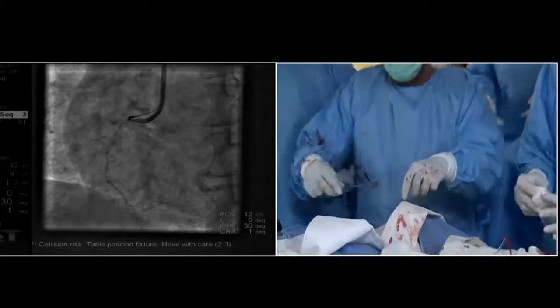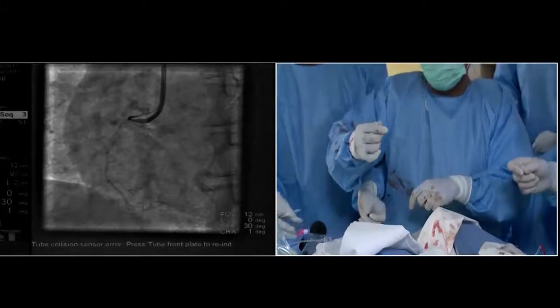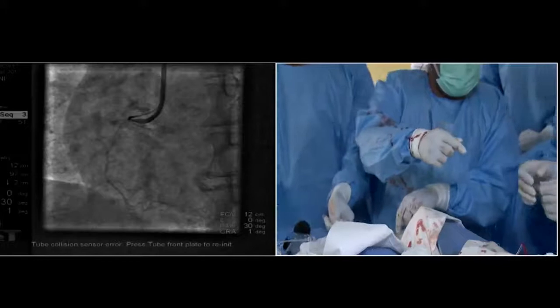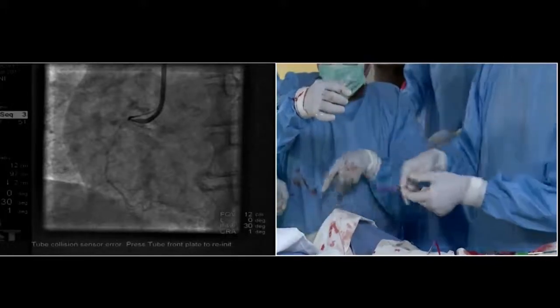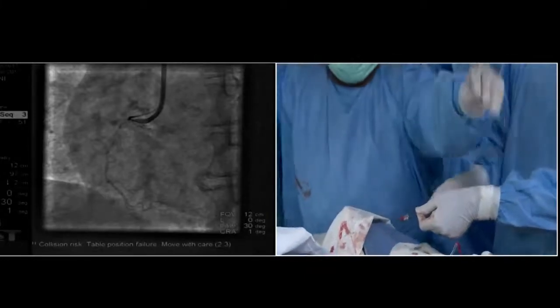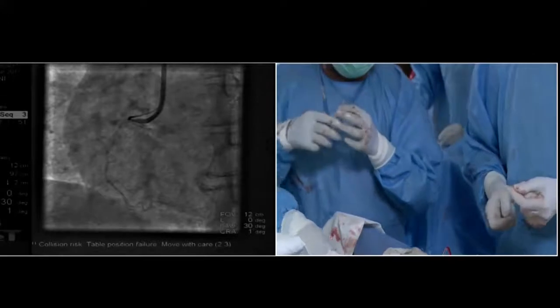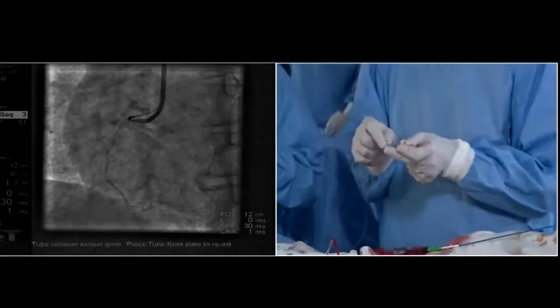However, if you decide to go with non-surgical revascularization, I think you should achieve complete revascularization to have the most benefit, including a good trial of RCA revascularization using microcatheters, different wire, different supports. Otherwise, this patient will be denied the long-term benefit of revascularization or some of the long-term benefit of revascularization.